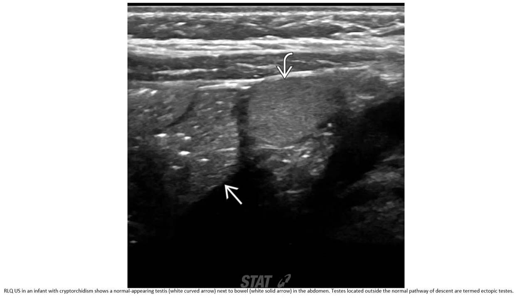This is the ultrasound of the right lower quadrant in an infant with cryptorchidism. A normal-appearing testis is seen next to the bowel in the abdomen — a testis located outside of the normal pathway of descent, confirming the term ectopic testis.